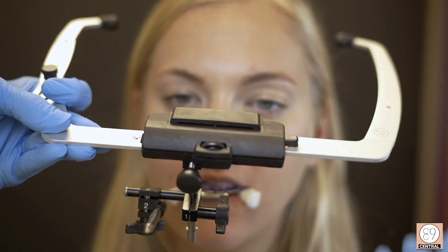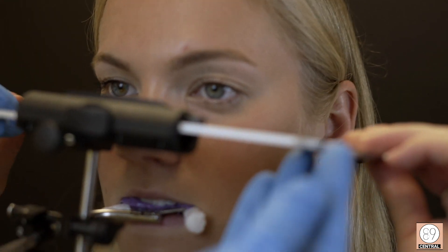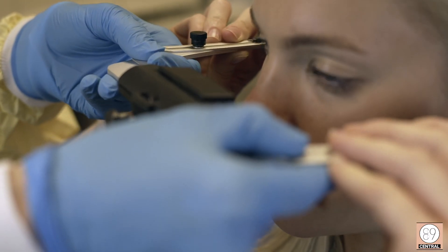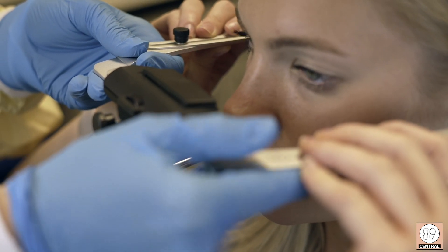Direct your patient to put the face bow into the ears to where it's comfortable. Then go ahead and demonstrate to them that they can pull it out and squeeze it in. We're determining the vertical position.